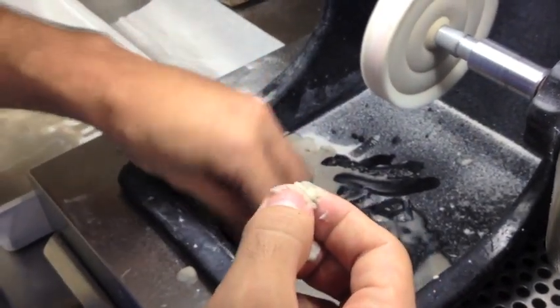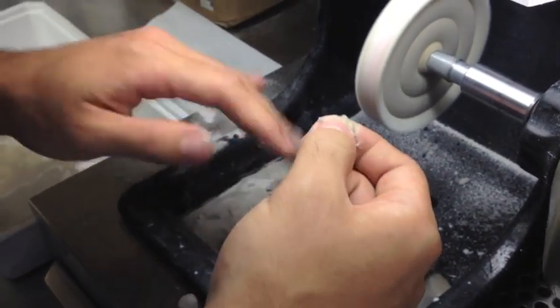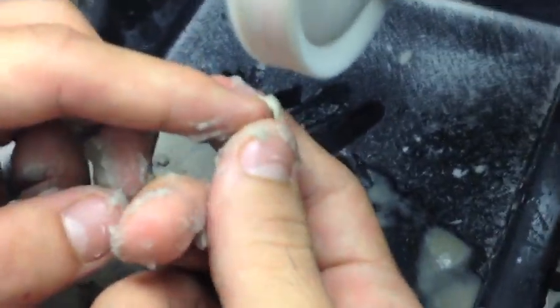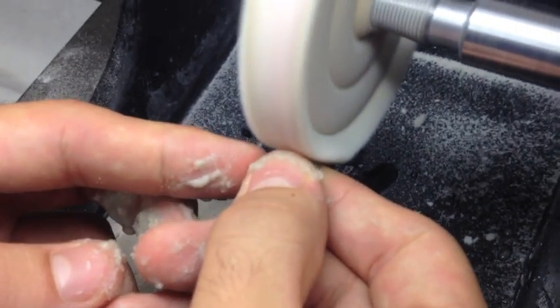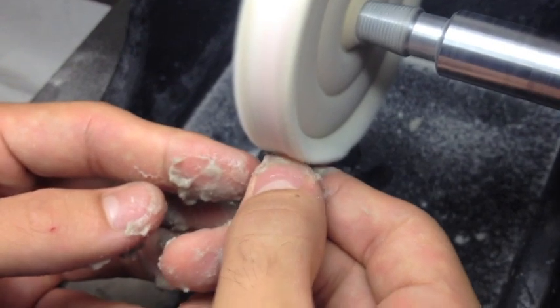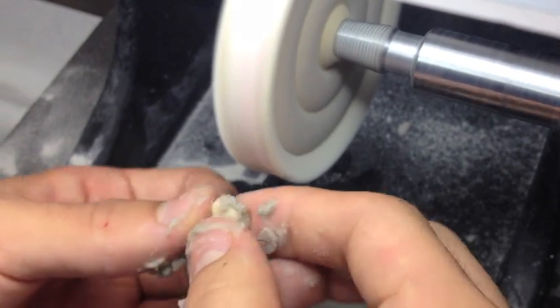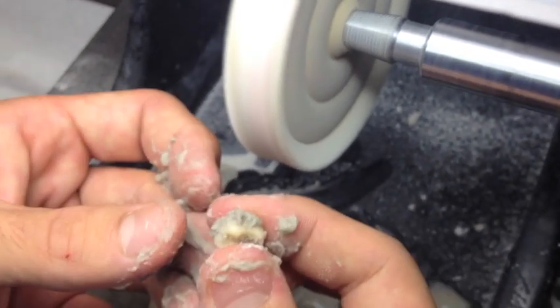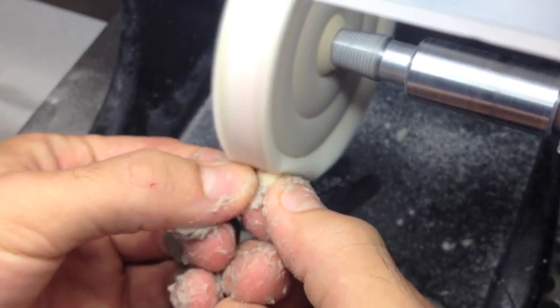When you're polishing your crown, you usually use pumice — coarse, medium, and fine. What you want to do is keep your fingertips on the margin so you don't polish off your margins, and always polish away from the margin. Don't polish towards the margin or you're going to lose it. Also, don't polish your contacts too much because you'll lose your contact — a lot of people make that mistake in the beginning. Keep it on there a couple seconds with firm, good pressure and light technique.